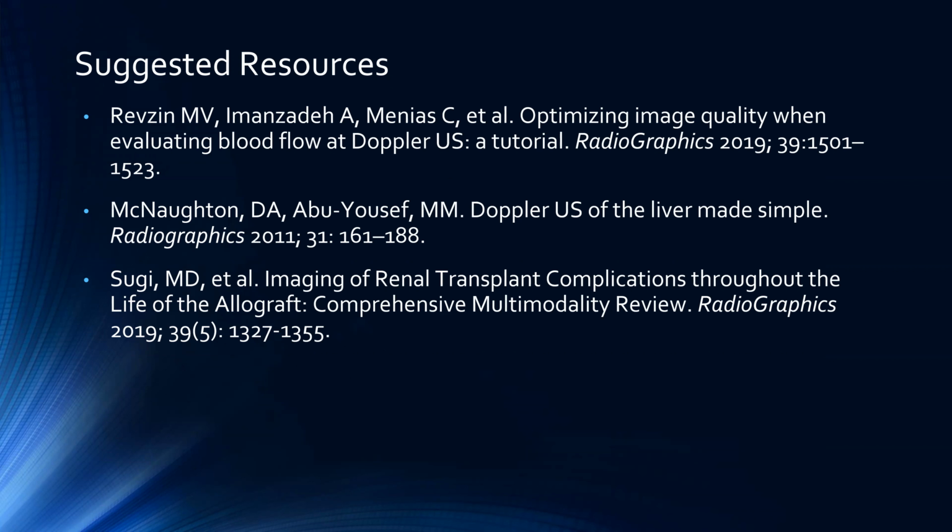So I saw that there was a question, if we're doing spectral Doppler for HCC assessment, are we billing for abdomen and Dopplers? So yes, that should be billed with Dopplers if we are doing a spectral assessment. But generally, we're only going to be doing a spectral assessment in the HCC if it's being requested. I don't think it needs to be done routinely once we've already done it once.